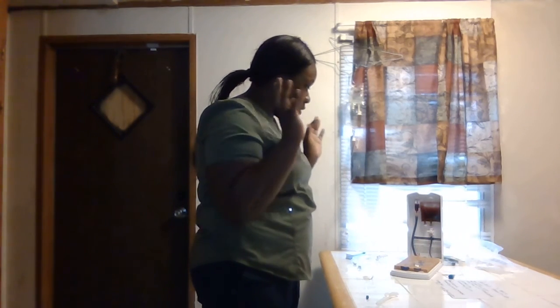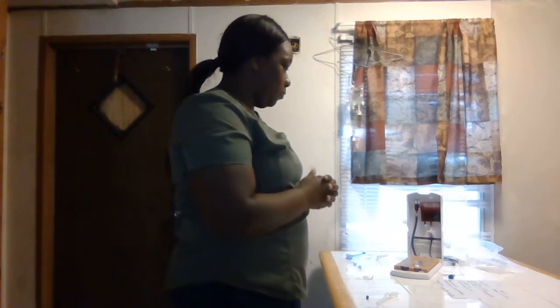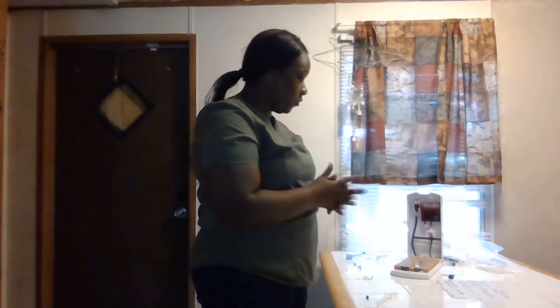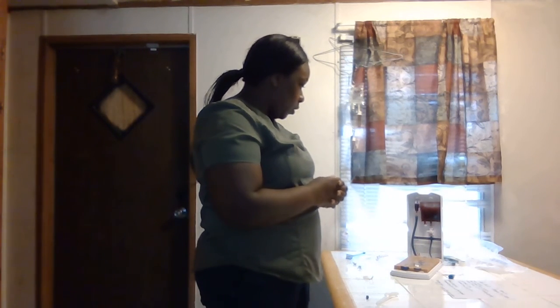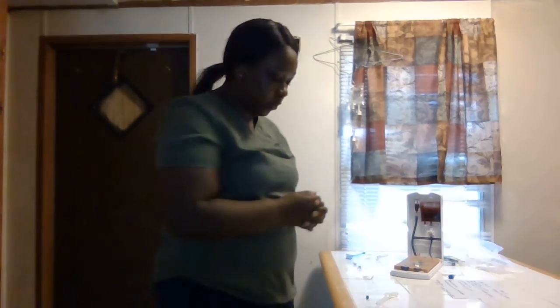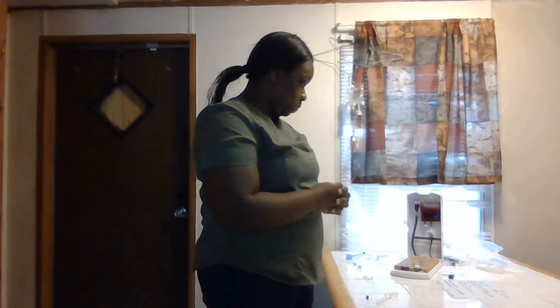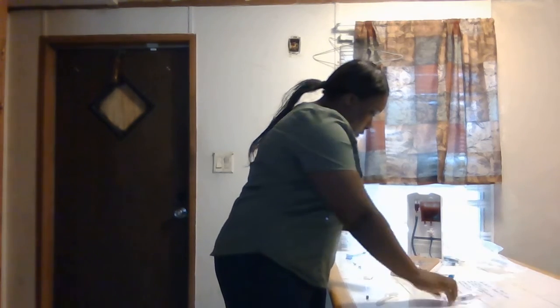Okay, so now he's back. The doctor ordered furosemide 40 milligrams IV push, Q6 hours. Again, you always verify the doctor's order, review the MAR, make sure you have the right patient, med, dose, route, and time. You do your 3 medication label comparisons to the MAR to make sure that this is the right order. And again, we do have furosemide 40, John Smith, date of birth.